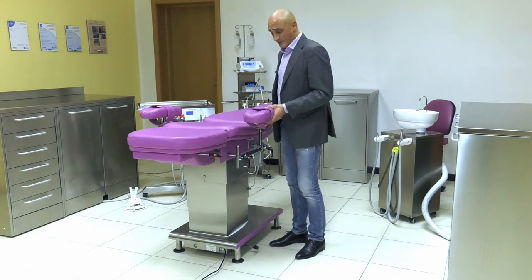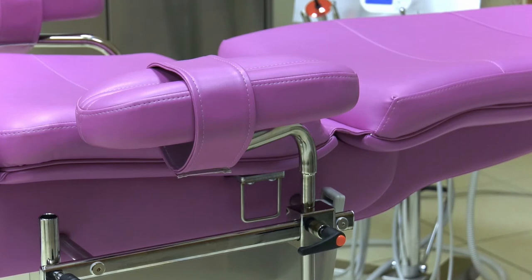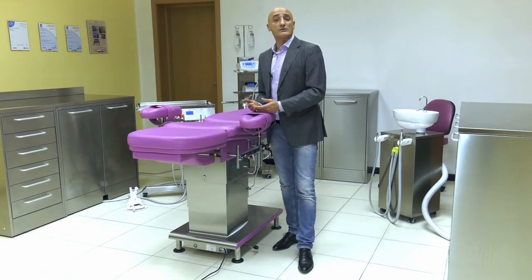I can also move the armrest away or bring it closer to the chair, so I can adapt the armrests in many different ways to allow the patient to be as comfortable as possible for the entire duration of the operation.